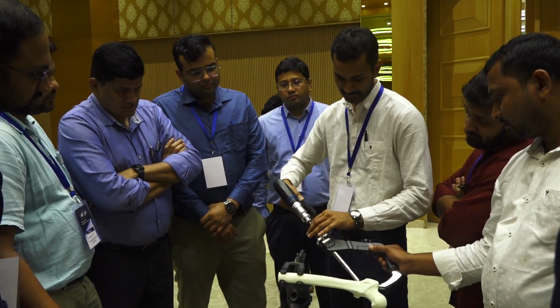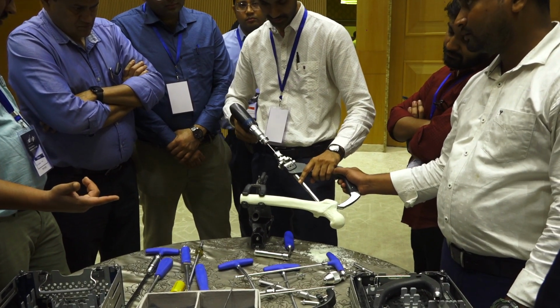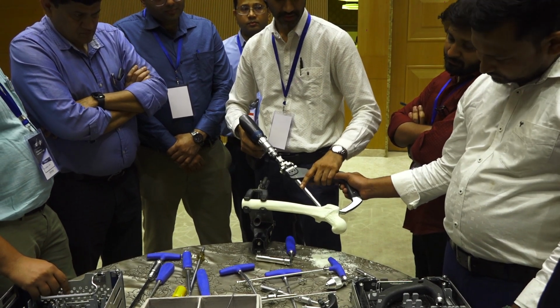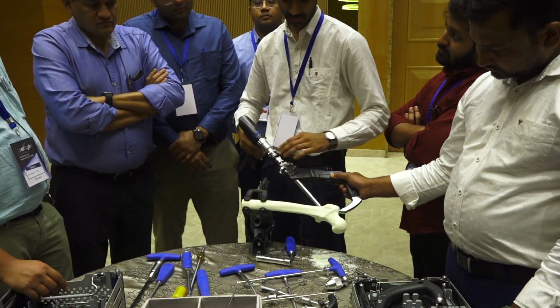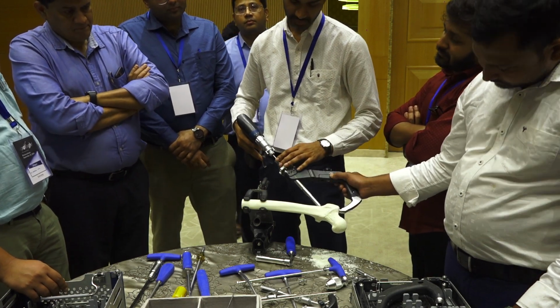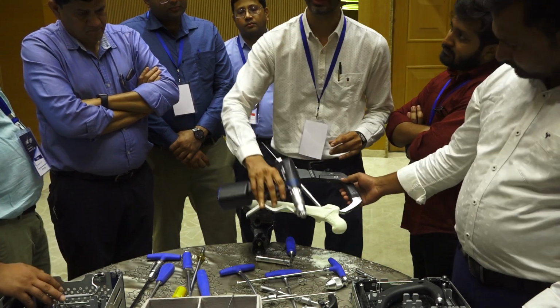So you will drill it. Check under here. Check under here and drill it. Don't over drill. Stay a minimum of 5 to 10 mm away from the apex of the femoral head. You have to stop, because if you drill too close, you can inadvertently penetrate the joint. In those cases, you can't do any cement augmentation.